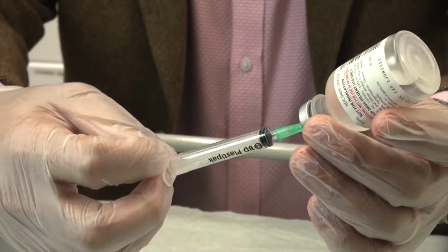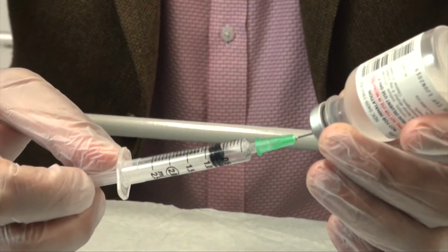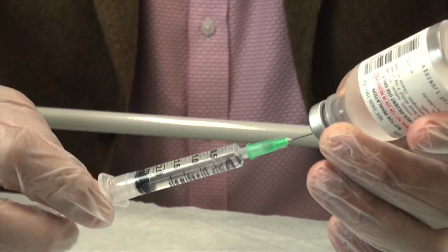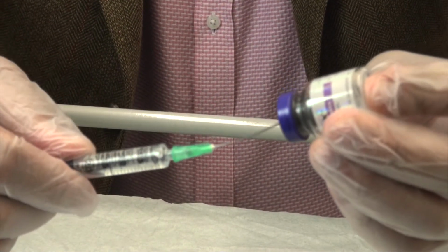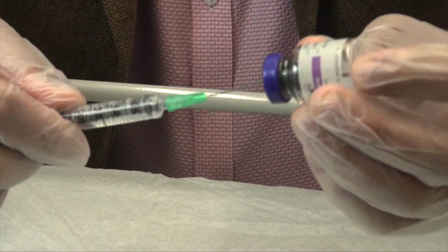Now I shall withdraw 2.5 mils of bacteriostatic saline, as so. Let's see, that's 2.5 mils, yeah, lovely. And then I shall gently introduce this into the vial.